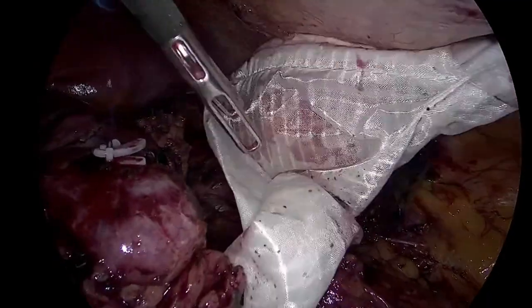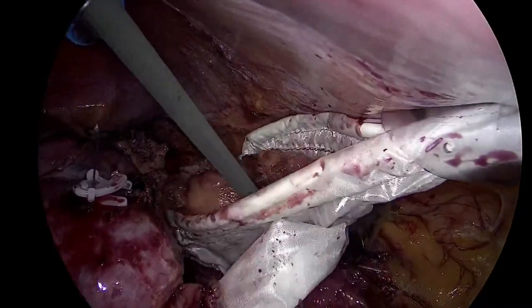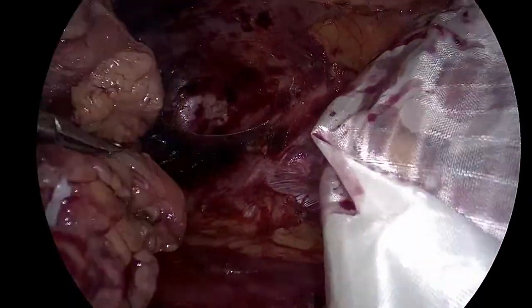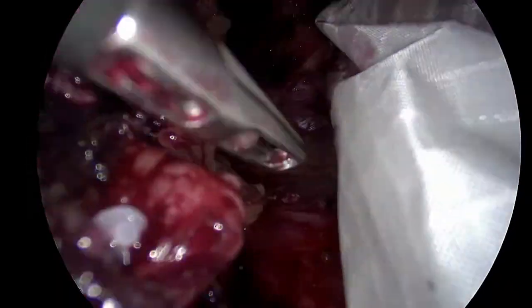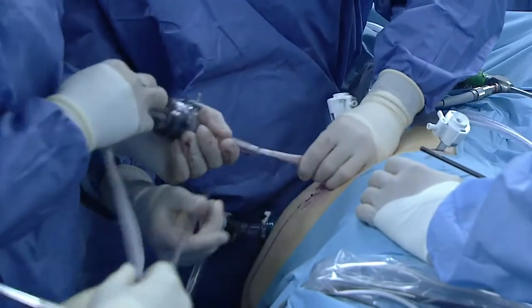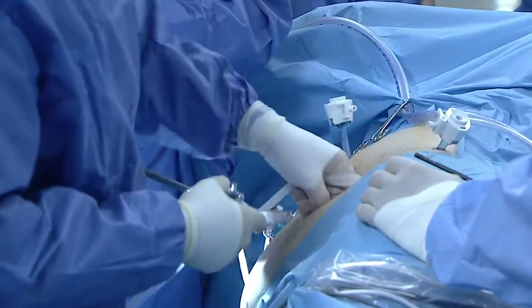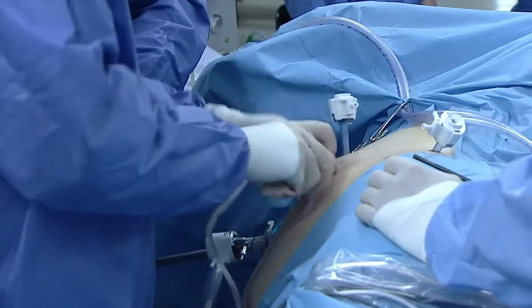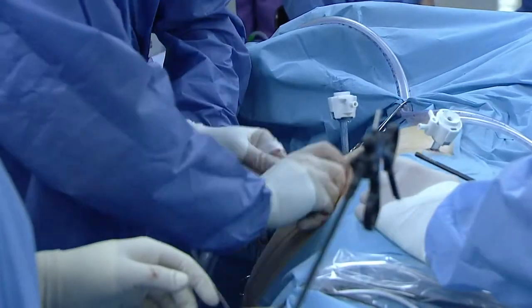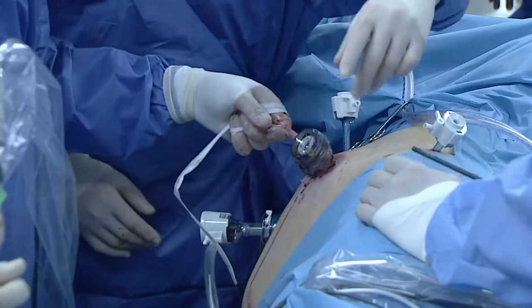Before closing, we check that both are inside. Come in here. I think there's both. Go back. It's outside. Oh, that's it. Now yes. Okay. Good. Wait, leave it. Go back in. We don't take the bag out. We go parallel to the bag with the trocar again. Give me a grasper. Clean the optic, please. Clean your trocar. Give me the trocar to clean it, please.